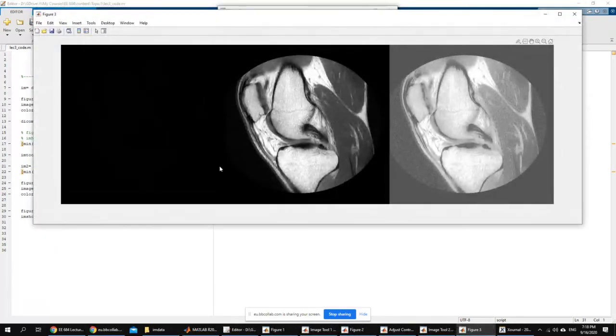Okay. See now, this is the first image. Basically, it's exactly the same problem that we saw before. This is the image adjusted. This is the histogram equalized. For the histogram equalization, you will see that even the noise in the background, you can see it now. See, the noise actually became very clear now.